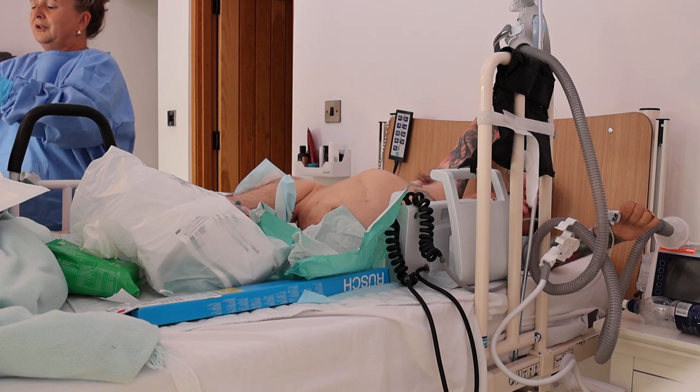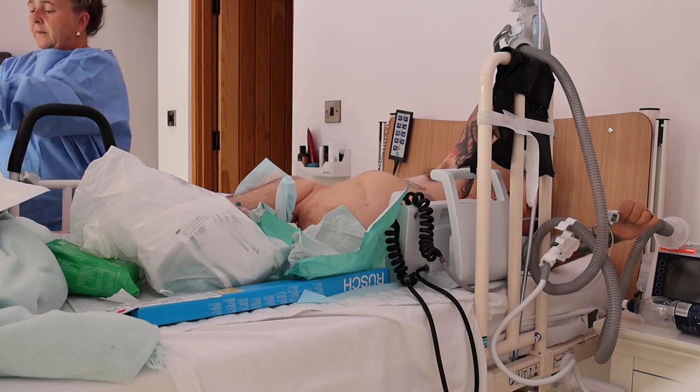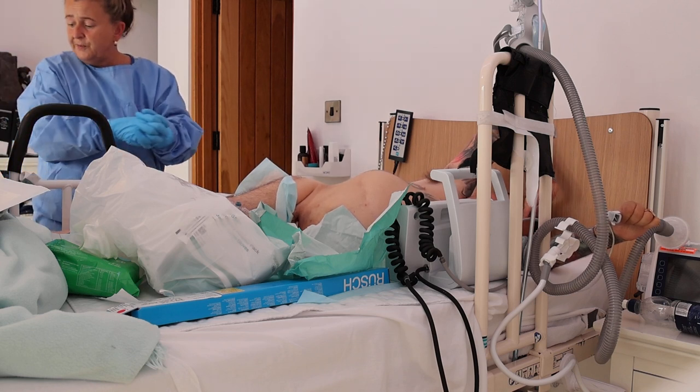All right, I have to wear large gloves because I can't have my fingers constricted. So make sure, a lot of people wear masks. I did wear masks, but they don't work, and they're not going to stop an infection like this.